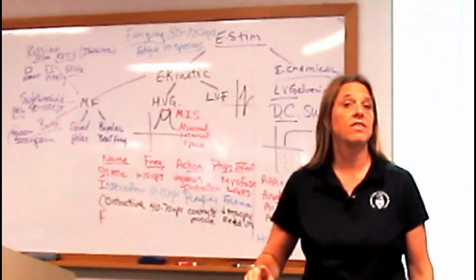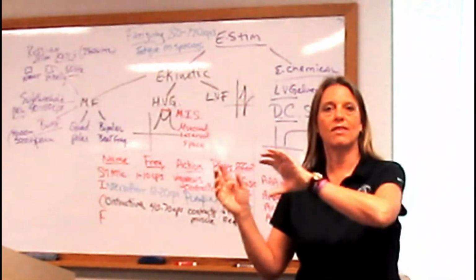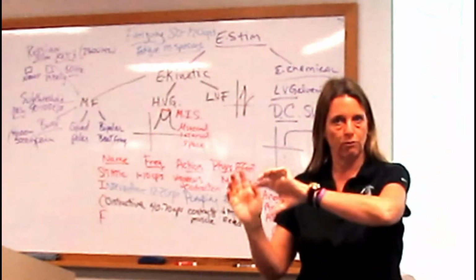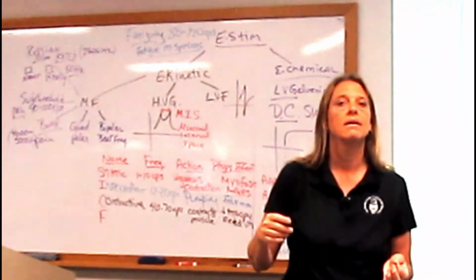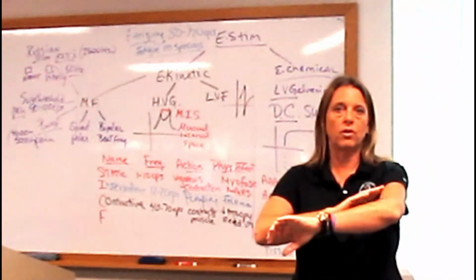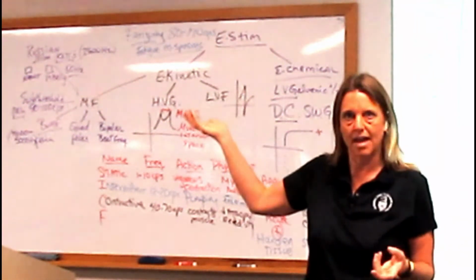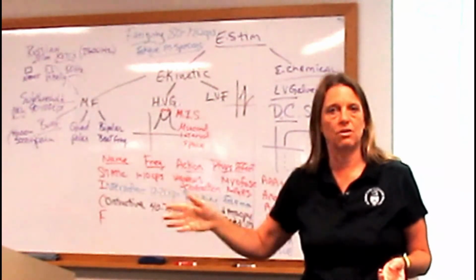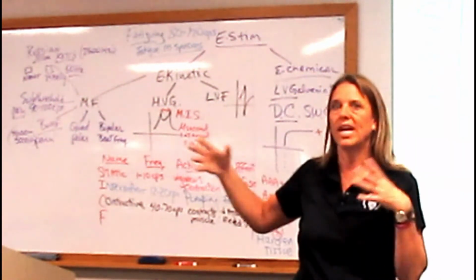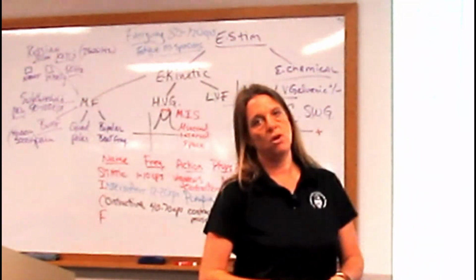If you don't want them to get used to it or accommodate, you can set it so that the frequency will change within the range for that modality setting. So for fatiguing, 80 to 120. And the patient will feel it going faster and slower and faster and slower, and it's like hearing a drip outside from the drains. If it's going at the same rate, you get used to it. But if it's variable, you can't get used to it.